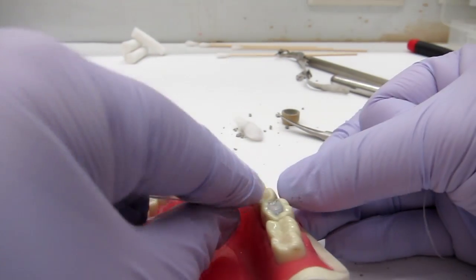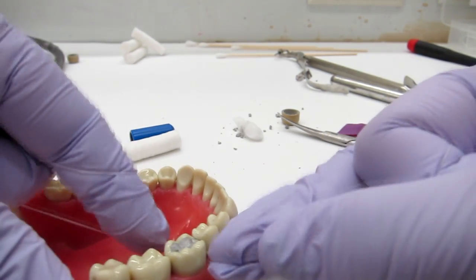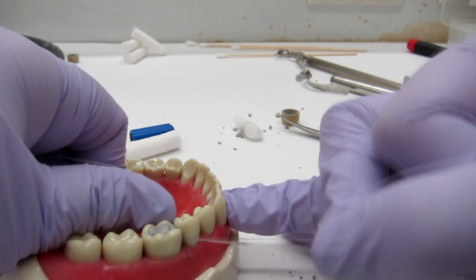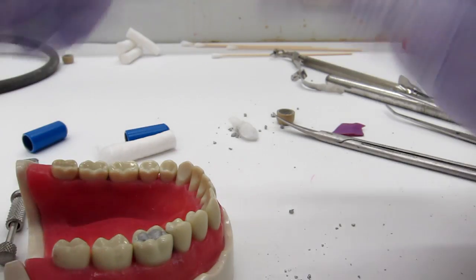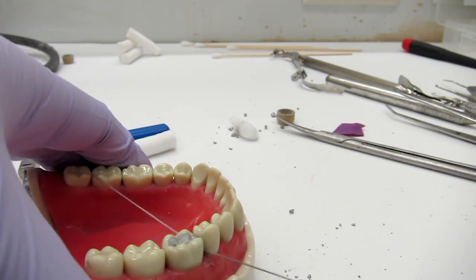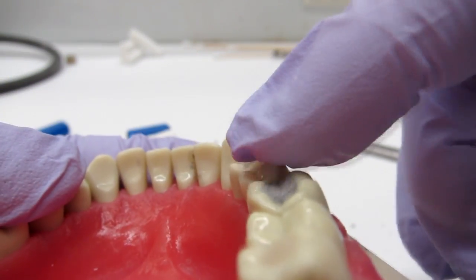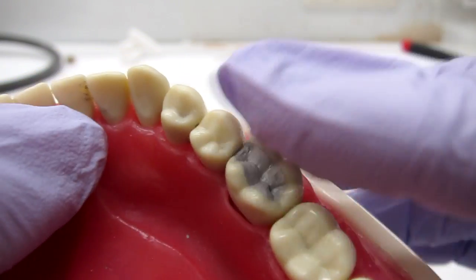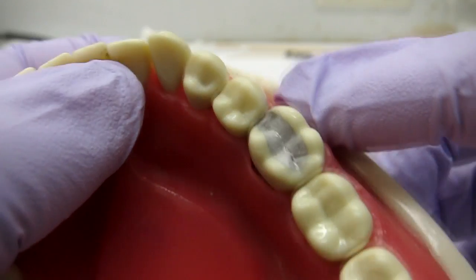Then pass floss very gently — you want to hear that snap. Make a C-shape on the side of the MO and also on the adjacent tooth because amalgam could have gotten stuck there. Don't pull up — pull out to the side. Do that a couple of times. Finally, make sure the central groove aligns with the rest of the central groove; that'll tell you if you need to carve more or if you've over-carved. Make sure the amalgam has the same contour as the remaining cusp — and that's it. Good luck!